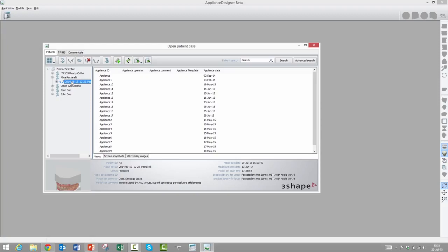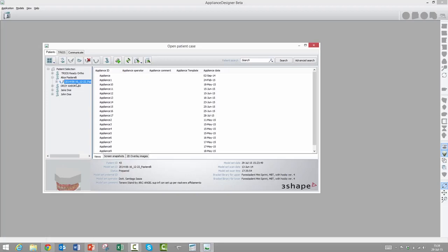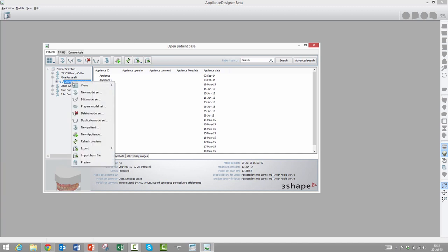Okay, let's have a look at how it works. We are now in Appliance Designer, and for those of you that have watched the first video on bracket placement, you will know that that was in Ortho Analyzer. So once that case was validated, then the actual bracket transfer happens in Appliance Designer. This is a validated case. If it wasn't validated, then we won't even be able to see the brackets inside Appliance Designer.